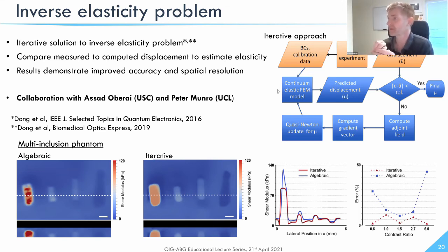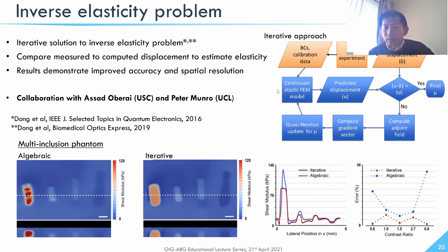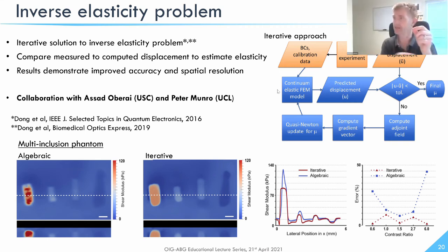So certainly digital holography, for example, and I think initially Amy Oldenburg a number of years ago looked at doing elastography with holography. But the issue with applying our particular technique to holography is that we rely on the depth section. So we need to have depth to measure that strain. So techniques where you don't have too much depth imaging may be more suited to the wave-based approaches, where you track the deformation across the surface of a sample, for example, and extract the elasticity in that way. And I think that's where holography has been utilized in elastography.